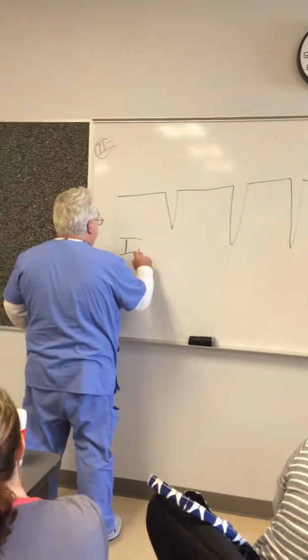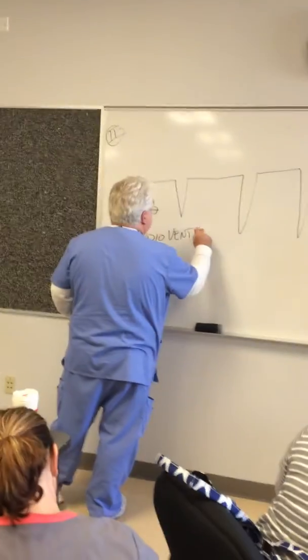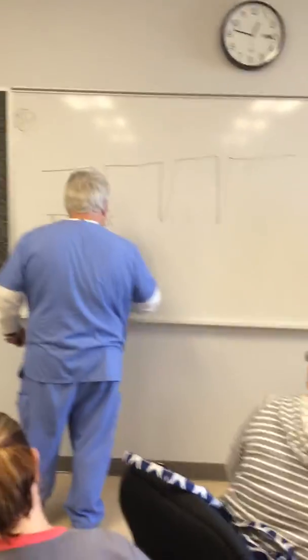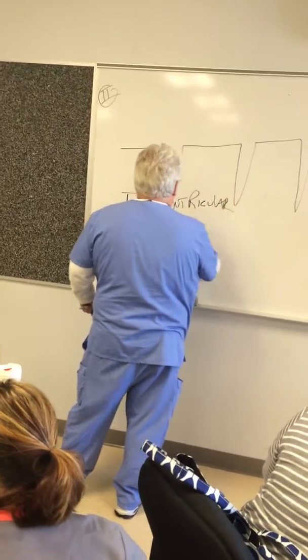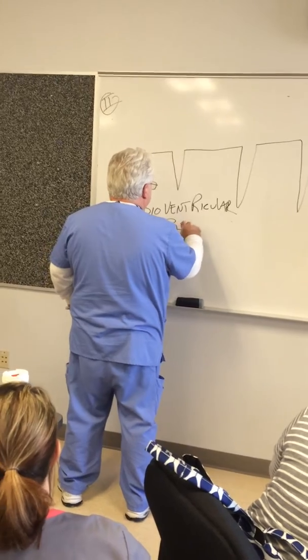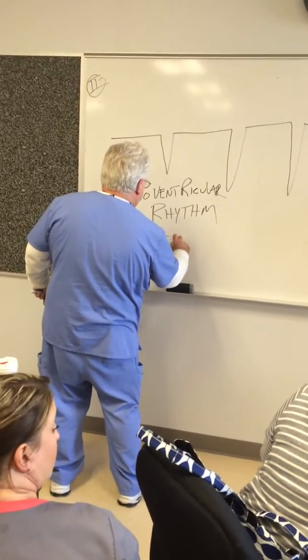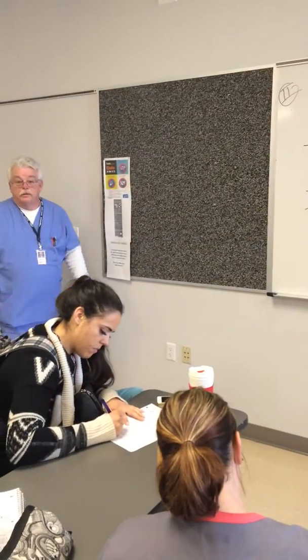This is called, this is not me showing off because this is in the homework, an idioventricular rhythm. It's abbreviated IVR.